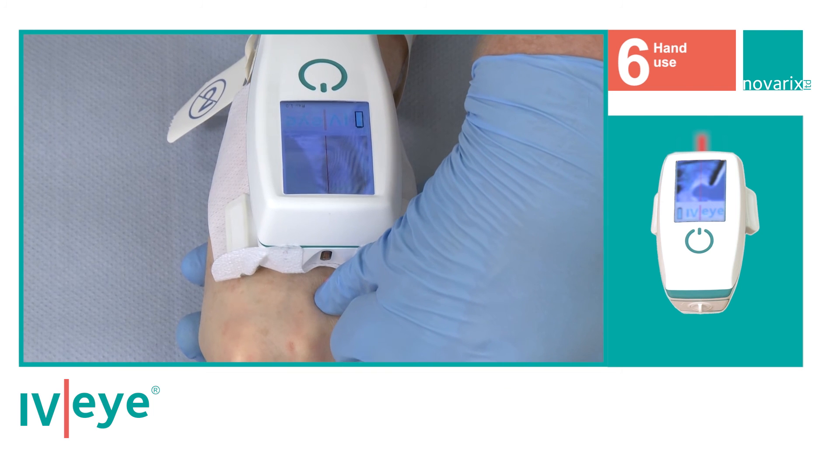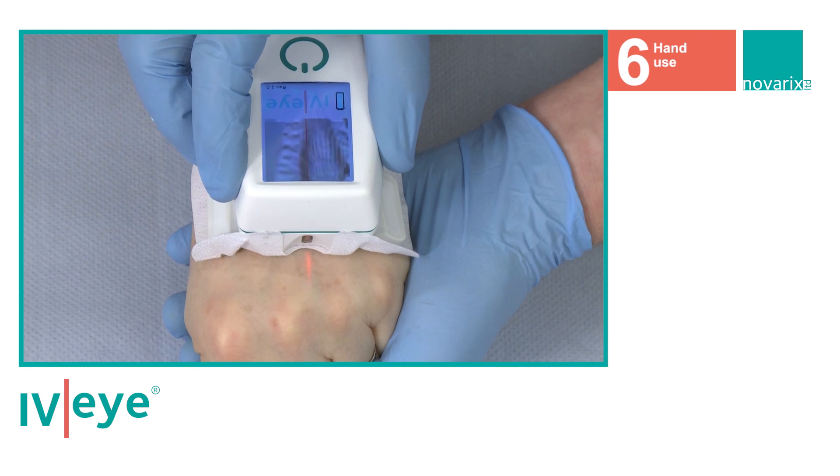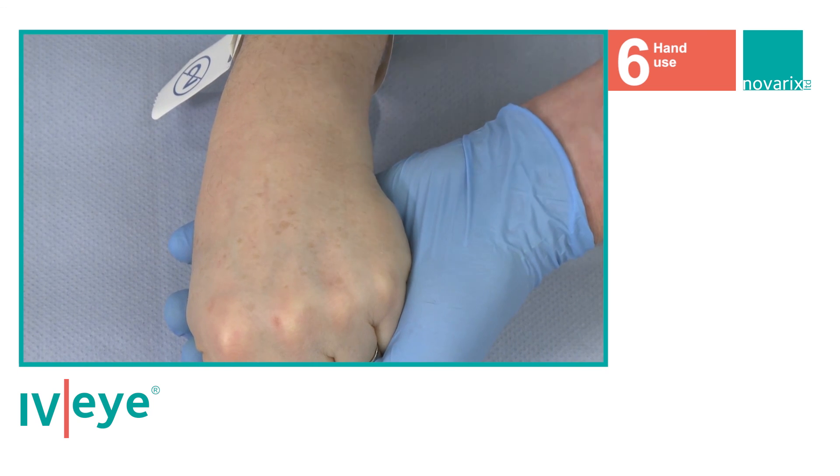Once the insertion point is marked, remove the device from the patient and clean and prep the patient as per your standard IV operating procedure.